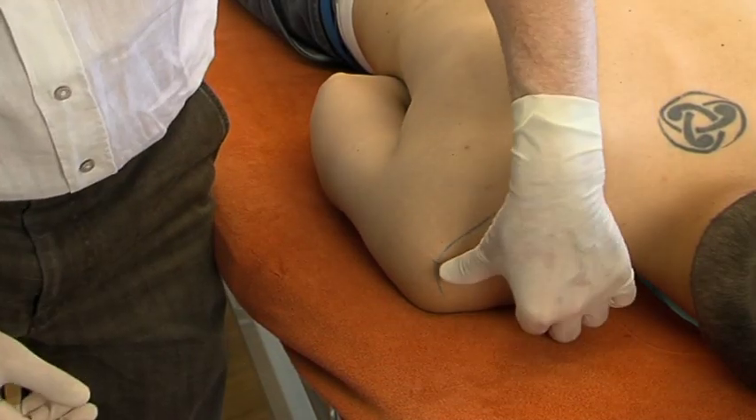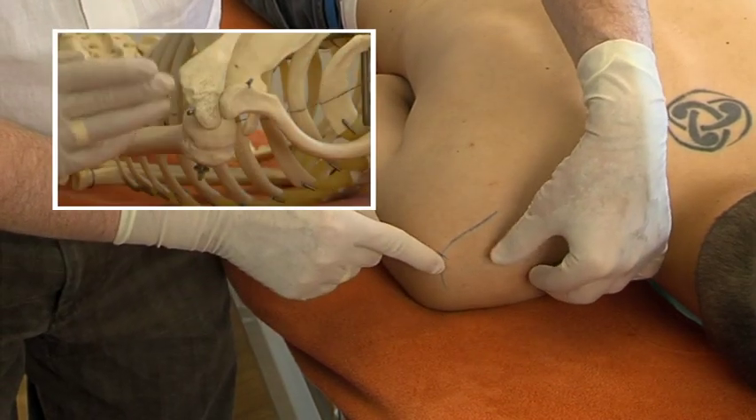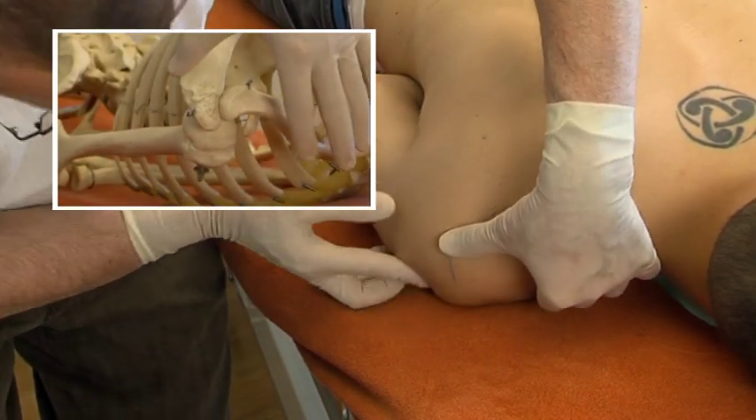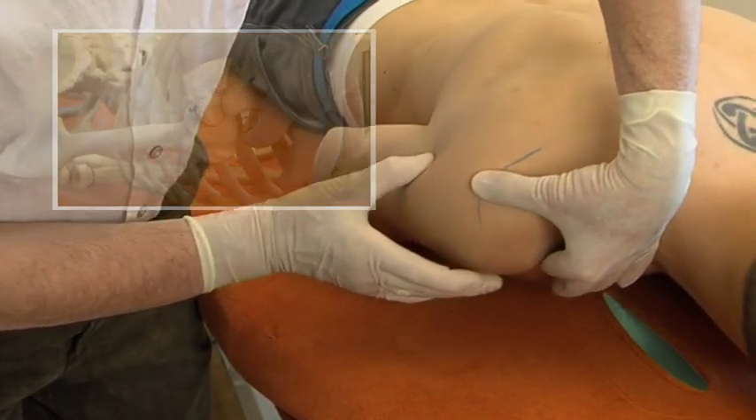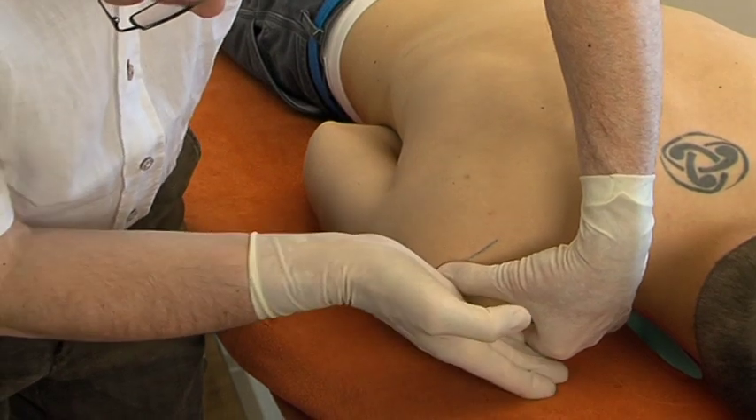The thumb is put on the point where the acromion and the spine of the scapula meet at straight angles. The index finger is put on the coracoid process. The line joining both fingers crosses the glenoid cavity.